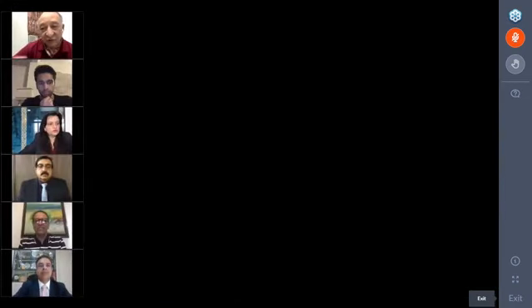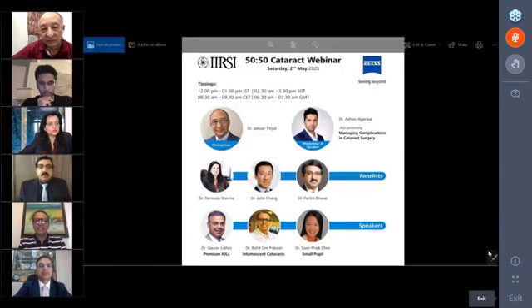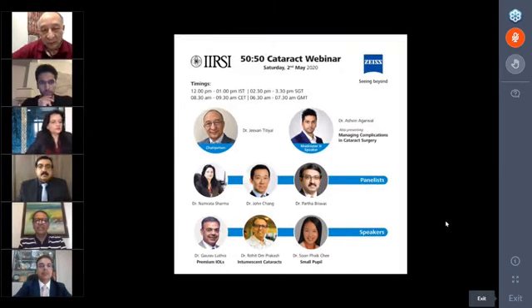So you can see the entire dynamics of the capsule, which Rohit beautifully described: the pressure induced by the viscoelastic, how the flattening occurs, what type of hydration of the cortical matter behind the capsule, and then you can plan your surgery accordingly. So anterior segment OCT can also give you those details.